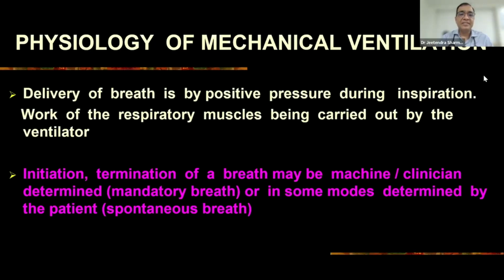Mechanical ventilation is delivery of breath by positive pressure during inspiration. That's a very important point: we are talking about mechanical, artificial ventilation. It is positive pressure during inspiration, and simultaneously the work of the respiratory muscles is offloaded from the patient to the ventilator. So the mechanical energy required for inspiration is provided by the machine. These are the two important features.